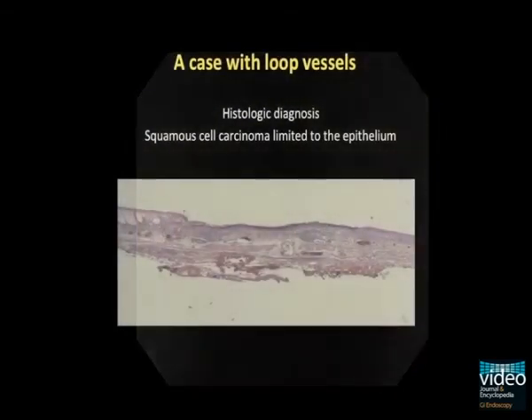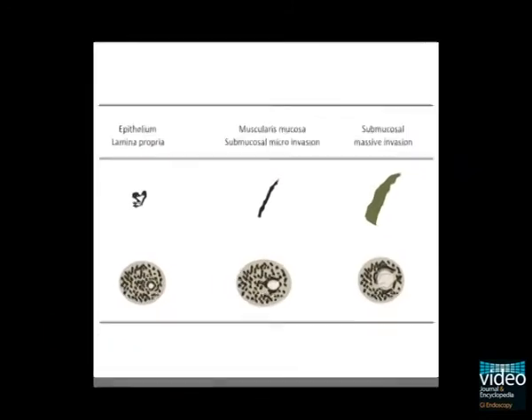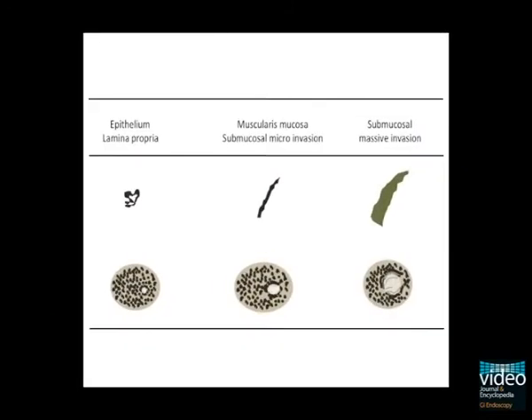When we observe the lesion at maximum magnification, we can see dilatation, tortuosity, and various shapes of the vessels, with brownish colour changes in the areas between the vessels. The histologic diagnosis of the resected specimen was a cancer limited to the epithelium.